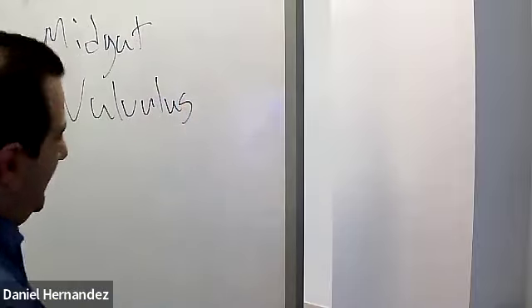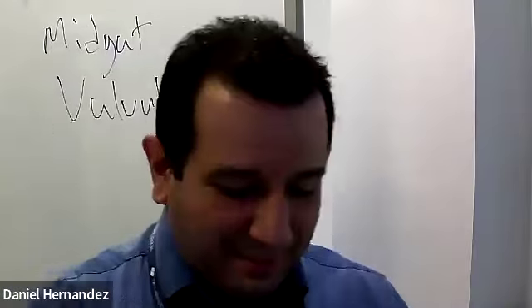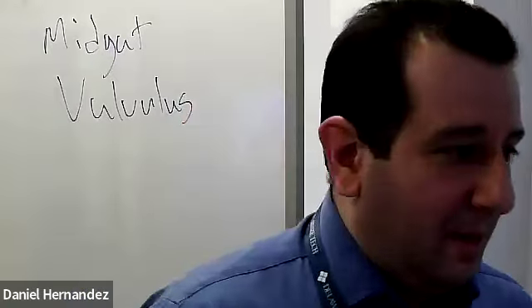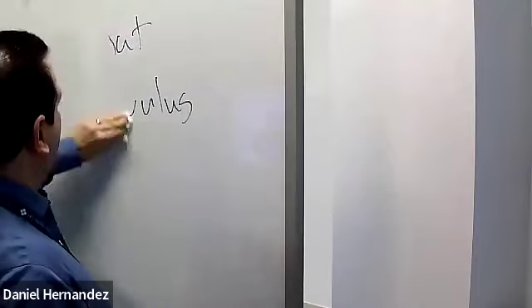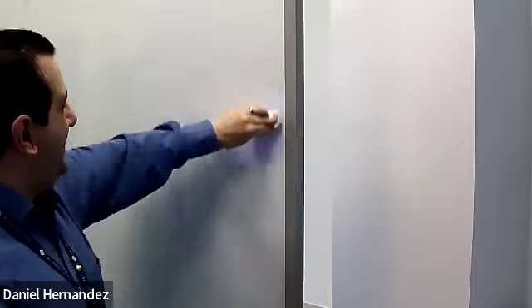I'm spelling that, midgut volvulus. Definitely butchering the spelling. Basically, that's a malrotation of the gut, so the intestines are essentially twisted. To rule out midgut volvulus or malrotation of the gut, we look for the orientation of the SMA and the SMV.